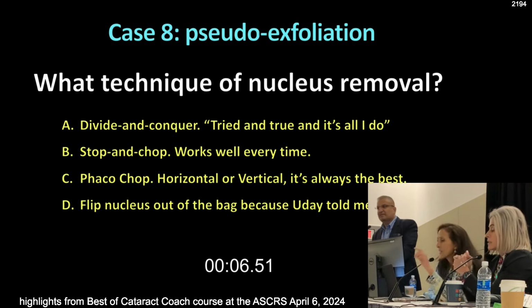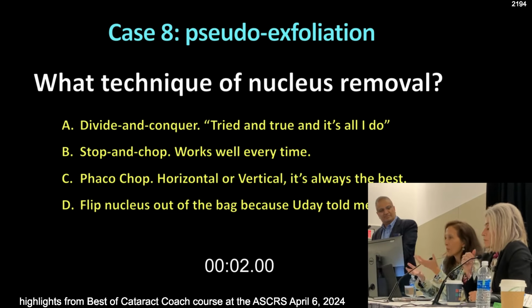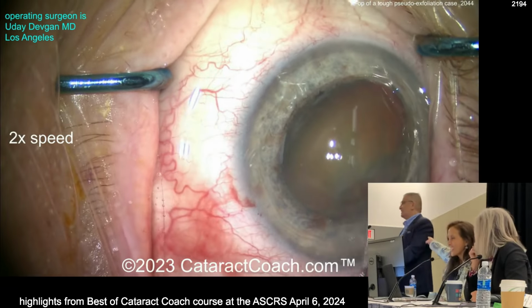Smart. And the other thing is I always do hydrodelineation. So I keep the epinucleus there supporting the bag as I'm taking the endonucleus out, which is a really helpful strut.